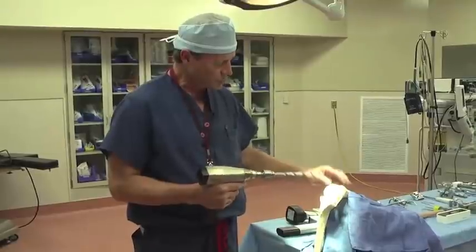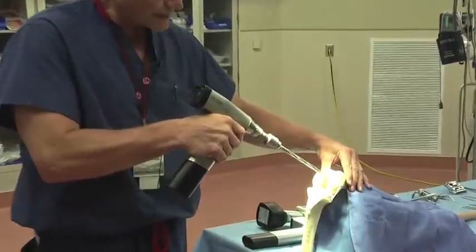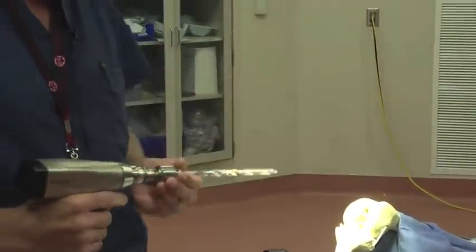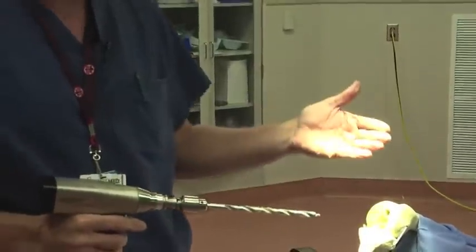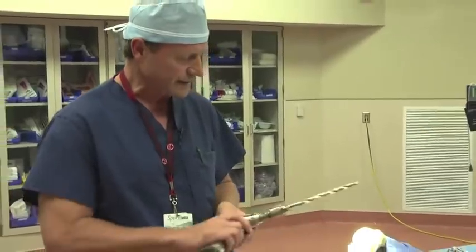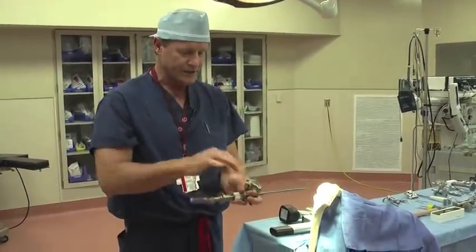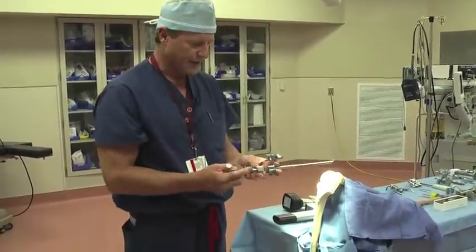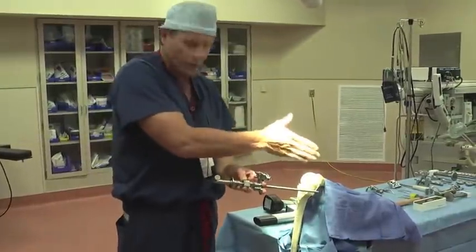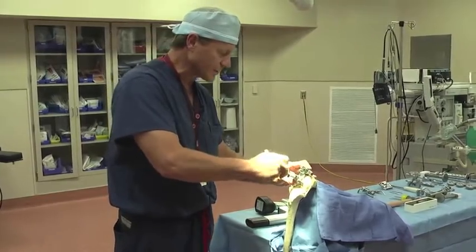We'll next use a drill to make a little pilot hole into the end of the bone right here in the femur, and we'll actually drill that down into the femoral canal. The reason we do that is that we have to have a guide to give us our alignment when we put that first jig on. We place in this alignment rod, and it has a cutting block attached to it, and it sets the angle for our cut. Normally we're going to set a five-degree cut on this distal femur unless there's something that dictates that we do different.